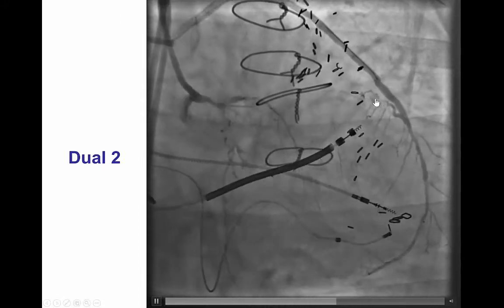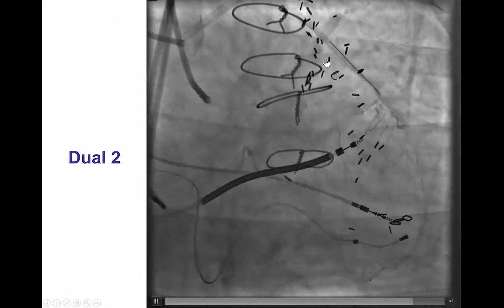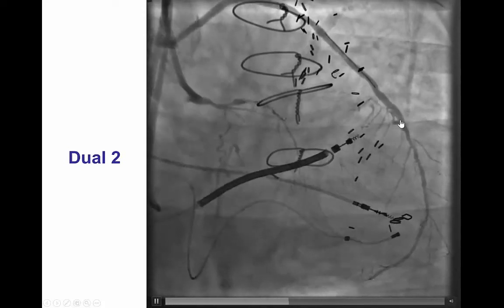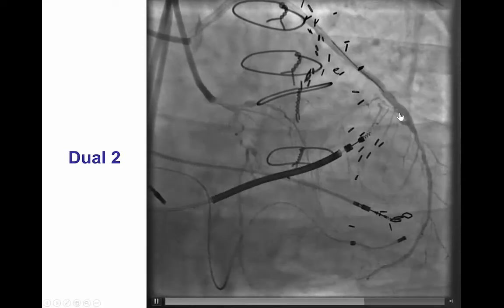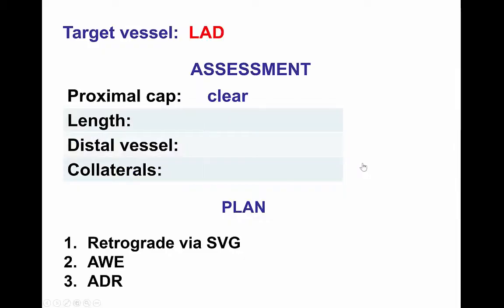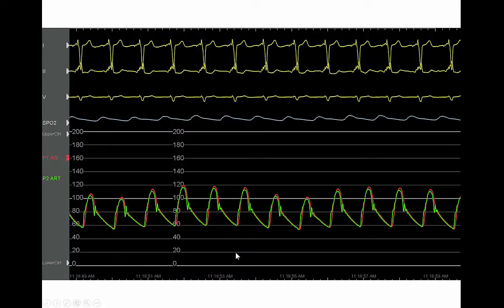It was a long occlusion, probably 60 or 70 mm. The distal vessel was filling well from the vein graft, and we had an excellent retrograde option given that the vein graft to the LAD was patent. So we had a unclear proximal cap, long lesion length, good quality distal vessel, and an excellent collateral in the vein graft. Given that, the initial plan was to perform retrograde crossing via the saphenous vein graft, and if that didn't work, proceed with antegrade wire escalation or antegrade dissection re-entry.